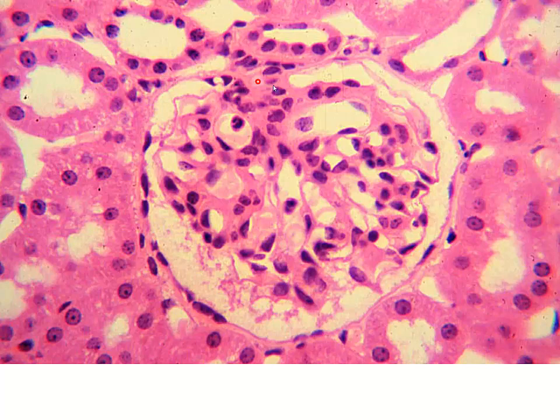Again, on the outside, we're going to see the cells that are our podocytes. And then we can see our capillary loops on the inside. And situated between, we are going to have our mesangial cells. Up in here, these would be extraglomerular mesangial cells. And in the middle, down in here, these are going to be our intraglomerular mesangial cells.